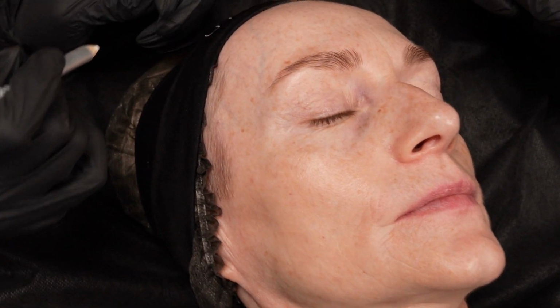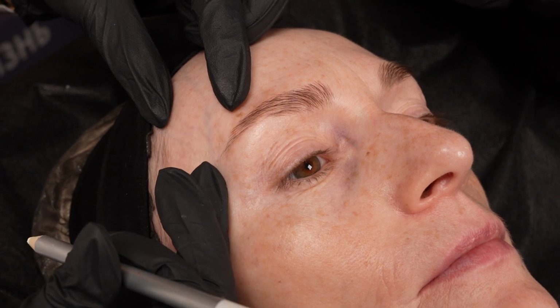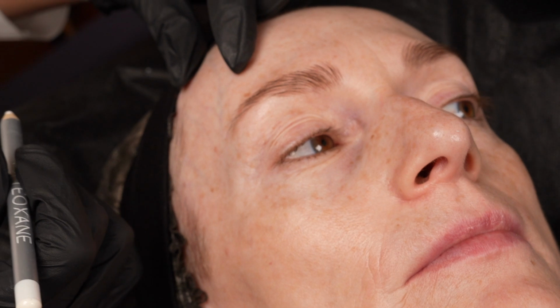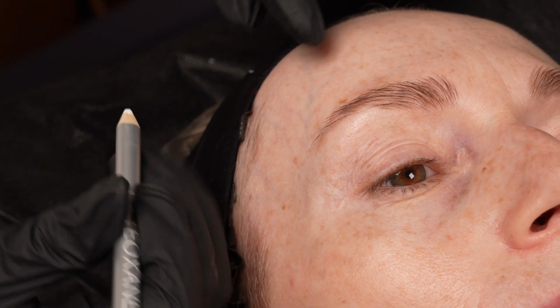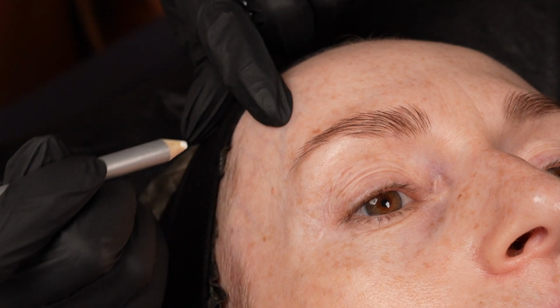Да, получается, я не часто делала коррекцию височной зоны. Но вы делали раньше? Я делала, да, буквально пару раз. Just two times she did. Okay, good. Височную зону. И я делала вкол, получается, с латеральной зоны, именно лобной. And the entrance point was the same like recommend?